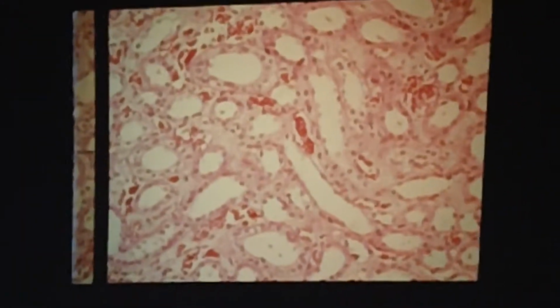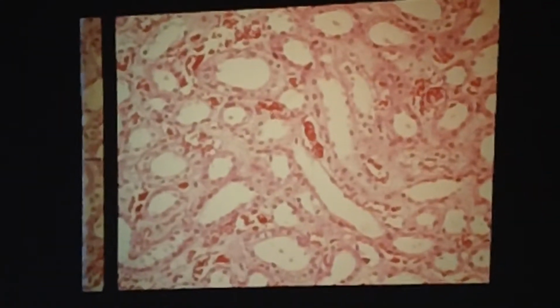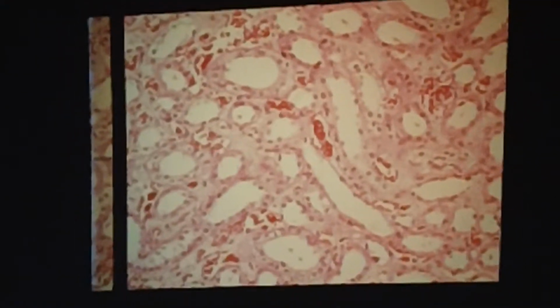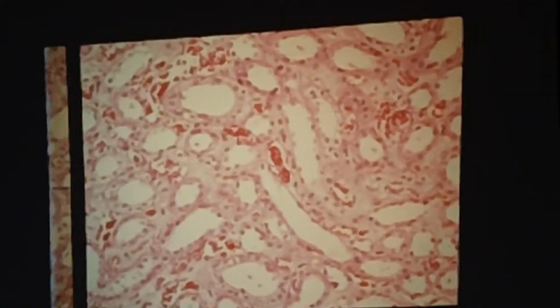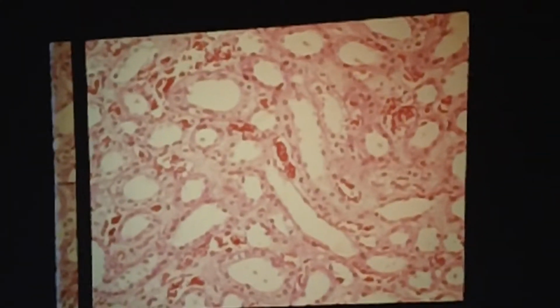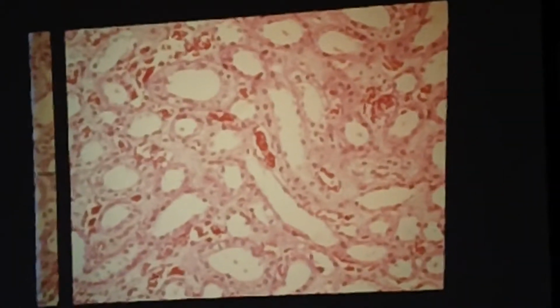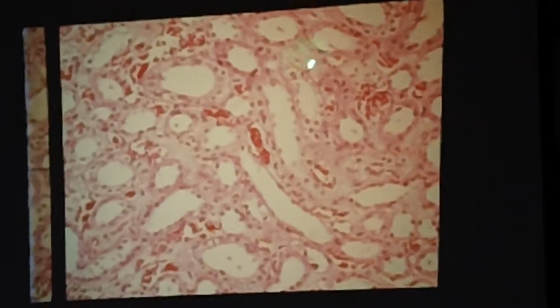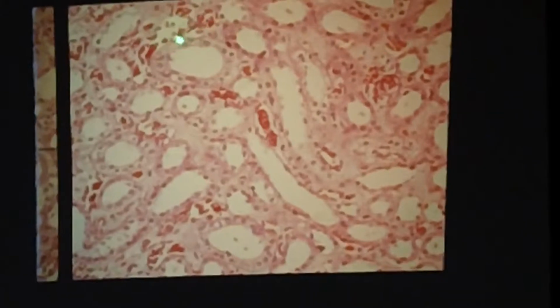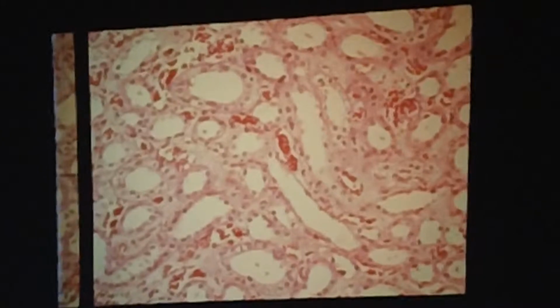So we've got to have left the cortex and we're down in the medulla. What are we going to call this right here? Either I'm getting deafer or you guys are turning the volume down to work me over here. It's a thin portion of the loop of Henle. You can see nicely in this prep all of the vasa recta. That's probably a collecting duct or tubule. I'm saying that because you can almost hallucinate the intercellular borders.